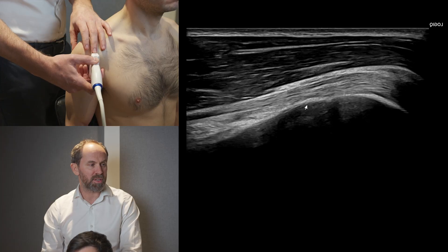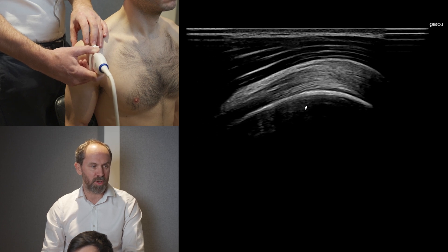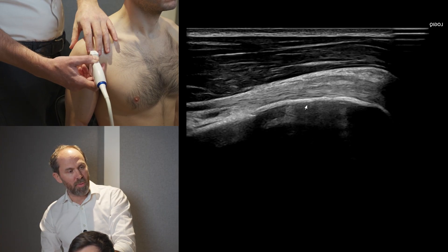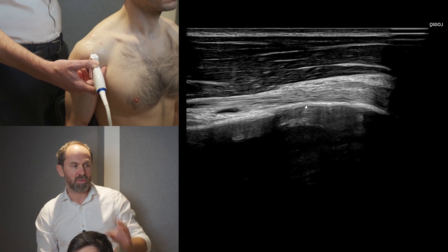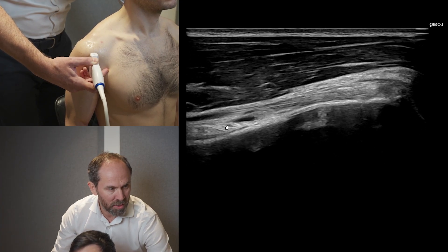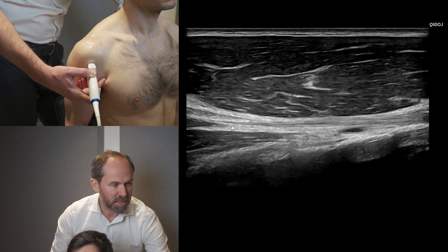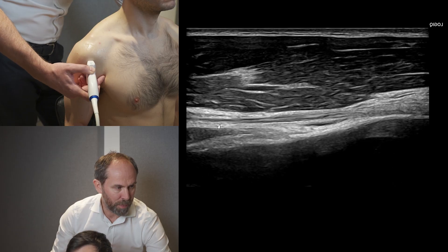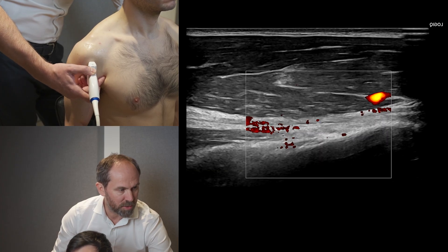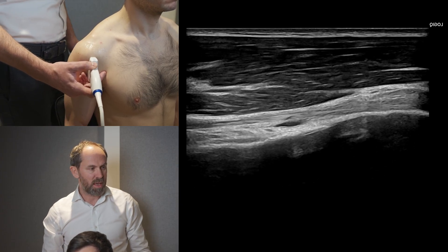We can follow the biceps up into the rotator interval, though we can't go very proximally to see the supraglenoid tubercle attachment. As we come back down, the biceps dives downward, so toe down the probe to stay on top of the structure — it's a fibrillar structure, and if you're not on top of it you'll get anisotropy. Toe down, stay on the tendon, and follow it down to see the musculotendinous junction. You may also see a little pulsing vessel — that's the anterior circumflex artery.